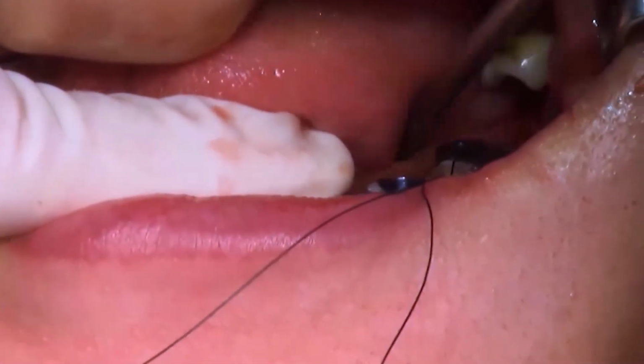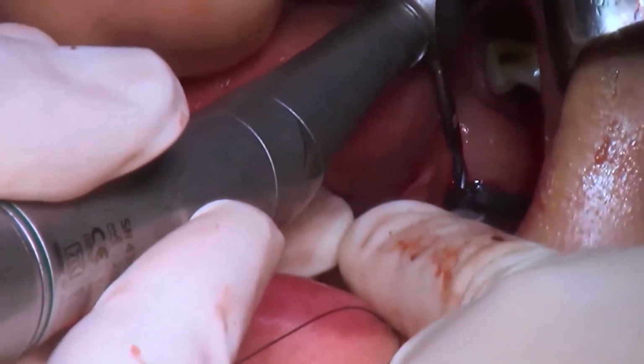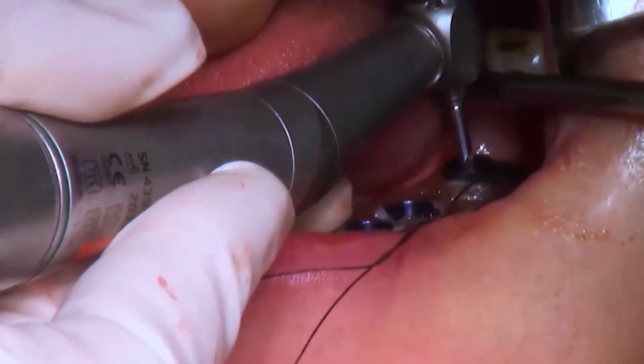The drill tube is tied up with a thread to prevent dropping it down the patient's throat.